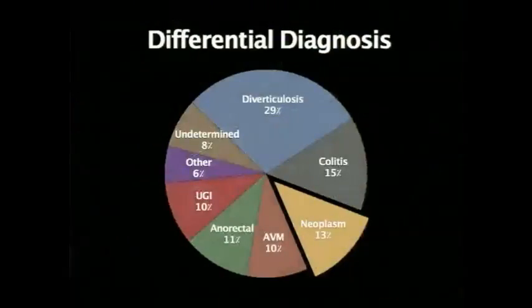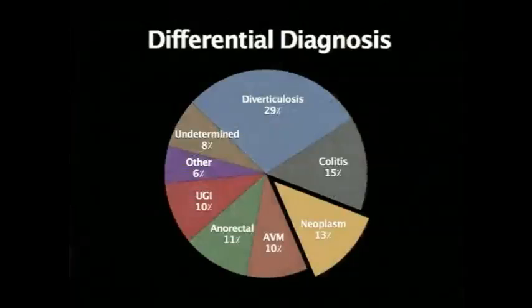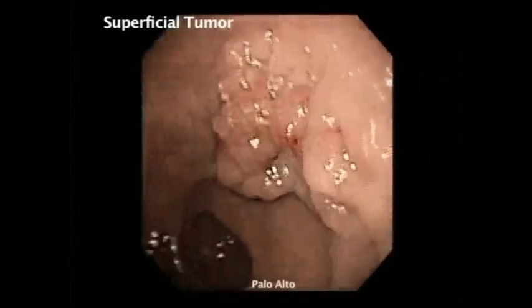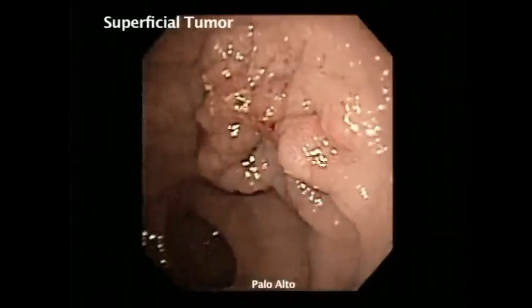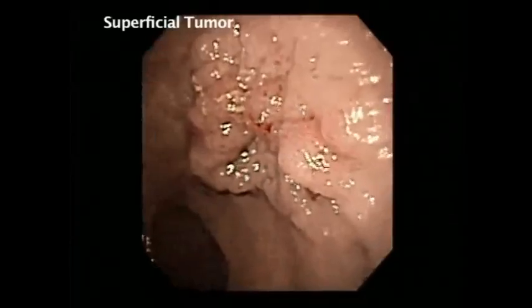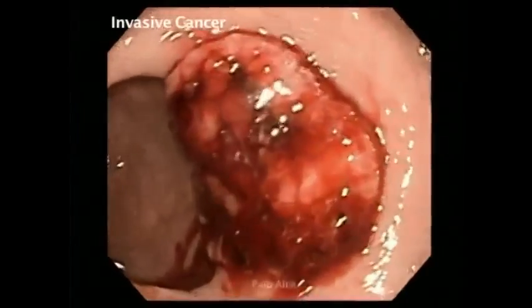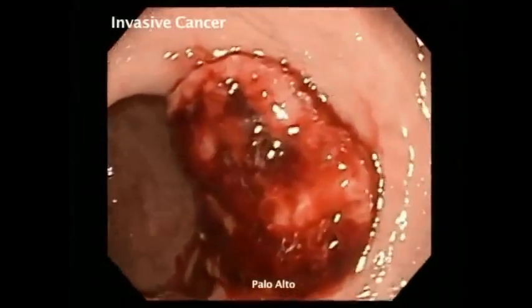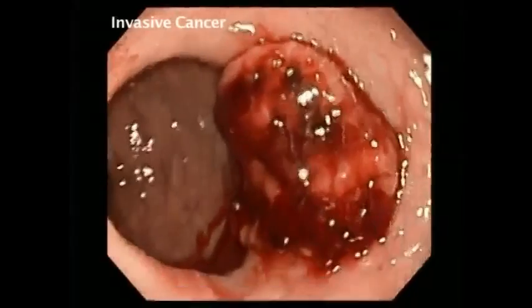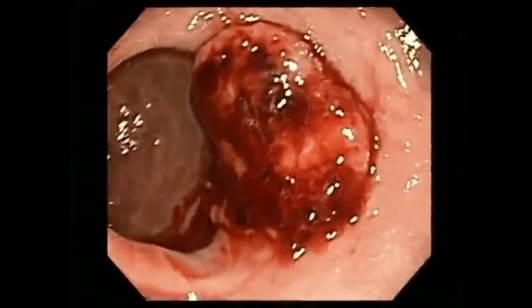Neoplasms account for about 13% of lower GI bleeding. Most colorectal adenomas do not cause severe bleeding until they become cancerous, such as in this case of an invasive rectosigmoid cancer hemorrhage that presented with bright red rectal bleeding.